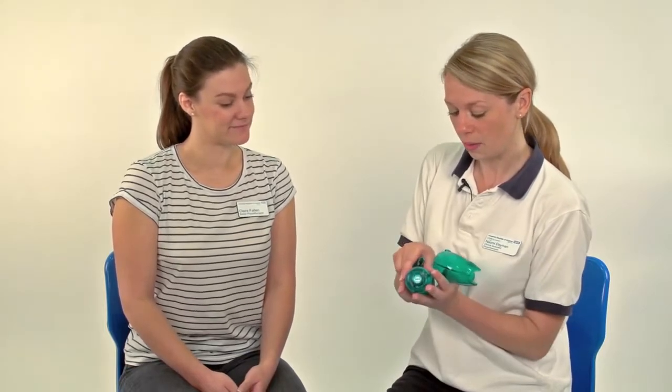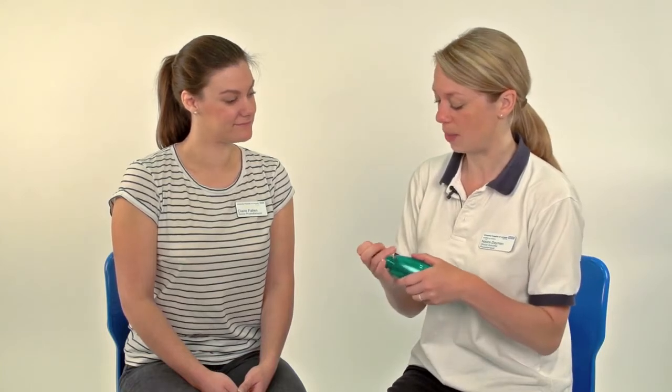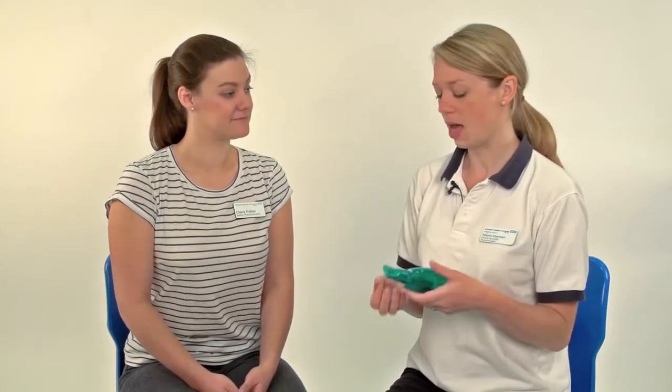I'm going to put this back together and then let you have a try using it to see how it feels. The only time we don't necessarily use an Acapella over other airway clearance devices is if you've got quite irritable airways. Sometimes people with asthma or irritable airways find that the oscillation irritates their airways too much and they don't tolerate it very well — it can make them cough quite a lot. So it's something you'd need to discuss with your physiotherapist to see whether this is the right choice of airway clearance technique for you.